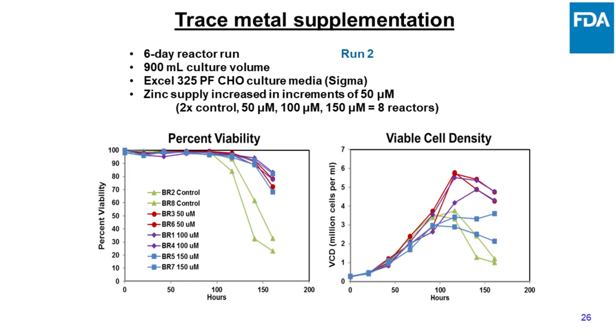Then we investigated in depth zinc concentration effect in a range of 0 to 150 micromolar, 0 being the untreated control. Zinc treatment was superior to control in terms of viability, but growth showed somewhat biphasic effect with better growth effects achieved at 50 and 100 micromolar concentration.